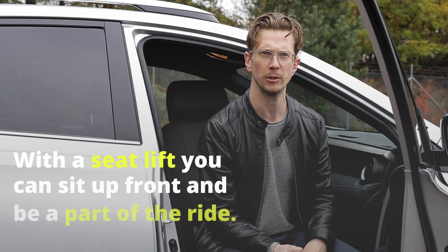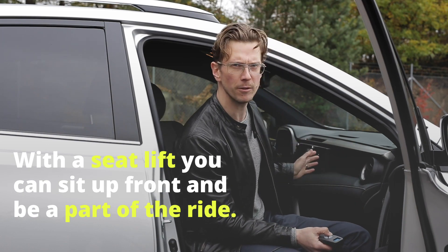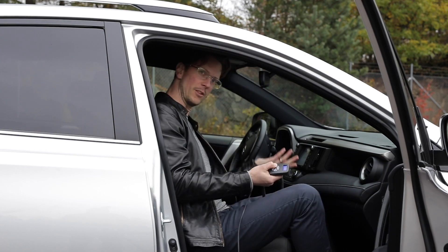The number one reason to choose a seat lift — or a swivel seat even — is you're part of the ride. You get to sit up front, you can talk to the driver, you can fiddle with the radio, or just sit back and enjoy the ride.